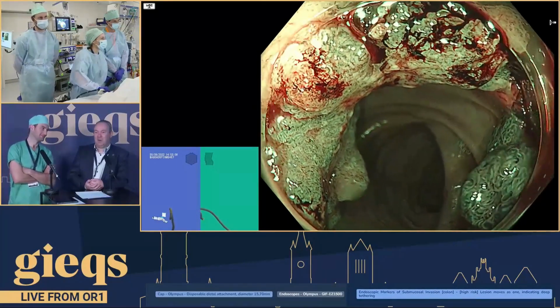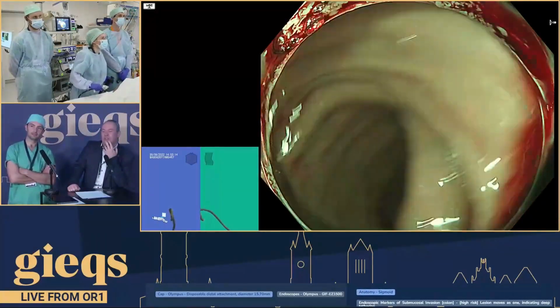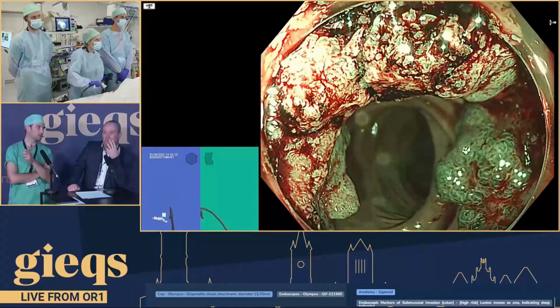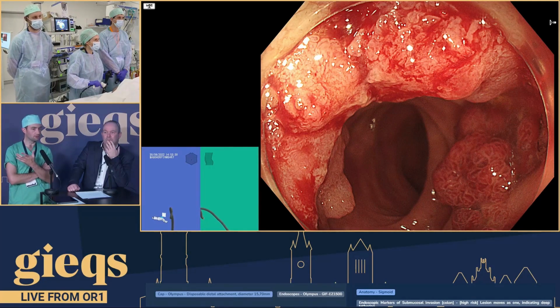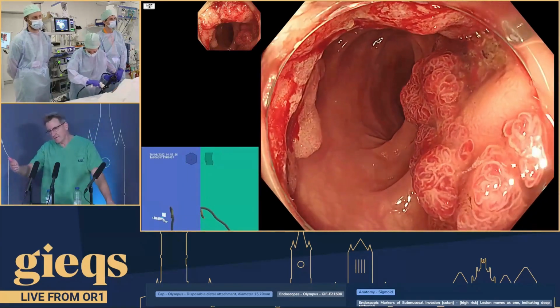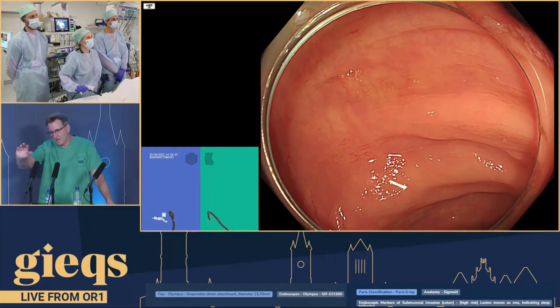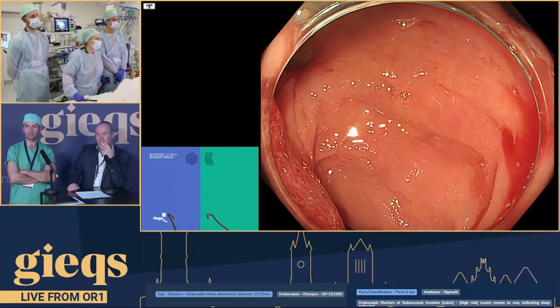Well, I was actually wondering myself while I was looking at that, and I was wondering how we can raise the awareness and a better assessment of lesions like this. Because to be fair to the person who did this, if that was pedunculated, that changes it totally, right? Of course. Like that imaging, you would still resect that. You still could go for that if that was pedunculated. Even as a subpedunculated polyp, it could be resected, only that at the back. So if the changes were at the tip, you could still do it by ESD with the hope that cure could be achieved by criteria, but the changes extend well down into the polyp. Ralph, what's your opinion about why someone's referred that as a pedunculated polyp alongside the other one?